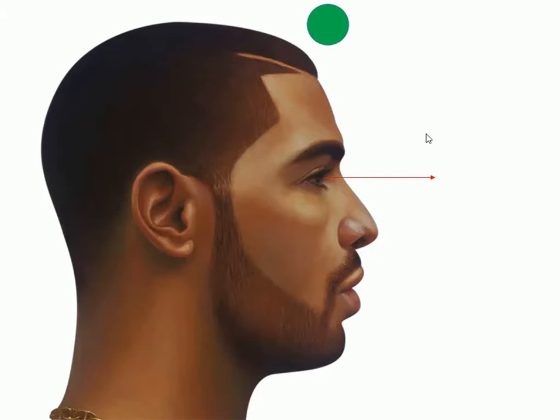When we consider the superior visual field and bring the ball down from above his forehead, he can pick it up at about 60 degrees. A normal person can pick up about 60 degrees, and again it's probably the build of the orbit and the brow that's blocking the visual field there. And from below, about 75 degrees, probably because of the anatomical build of the zygoma in the cheek area, which obstructs the view from seeing completely downward.